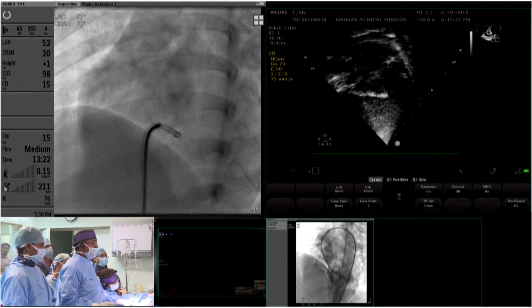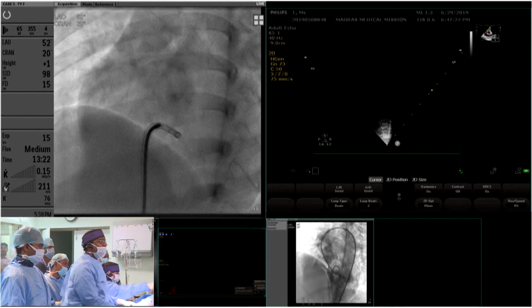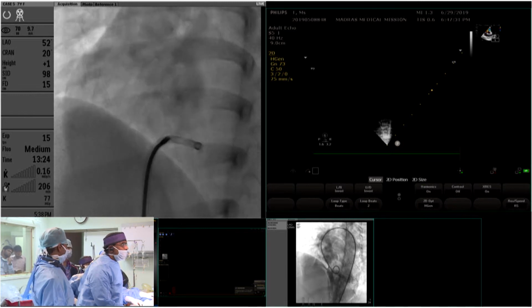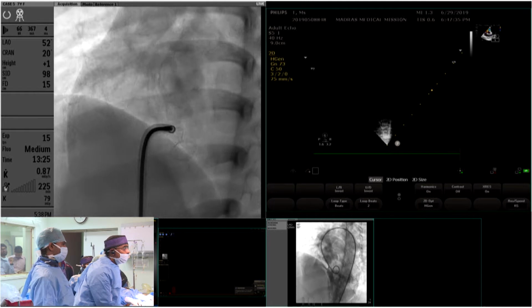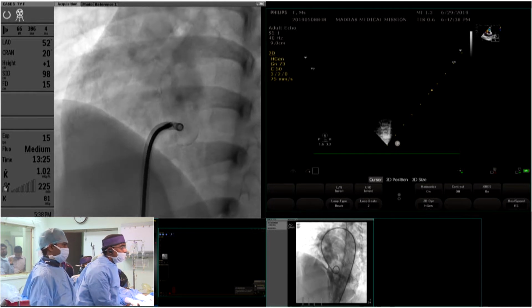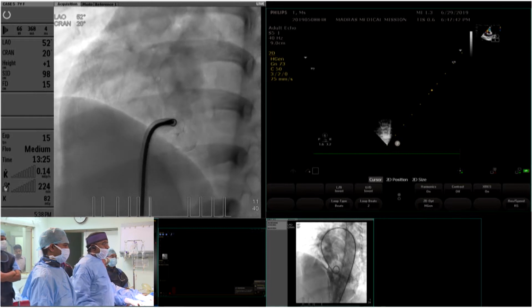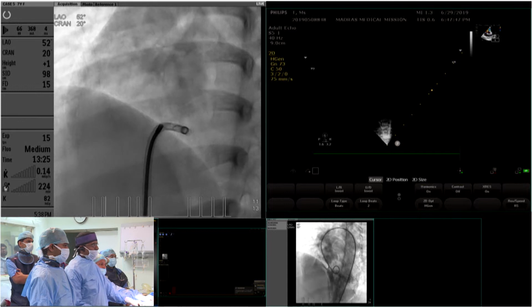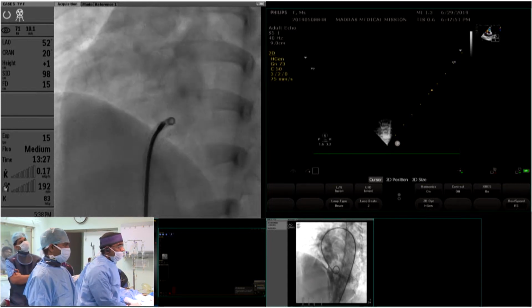Okay. Can I come a little bit closer to the septum and then try to open? Take your hands out. It looks like I'm quite out. Okay, now it is forming. Oh, there is some memory abnormality of this device. Now it has reformed again. Okay, now we are going to be coming closer to the septum.